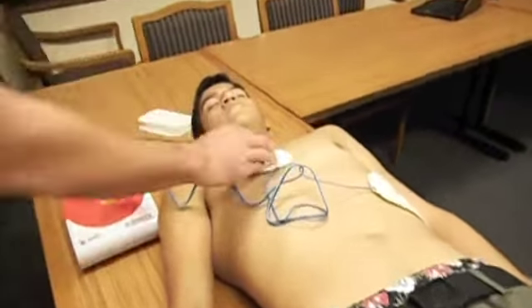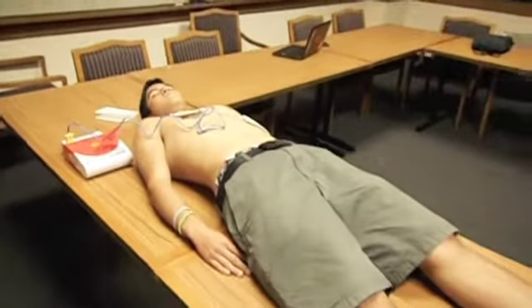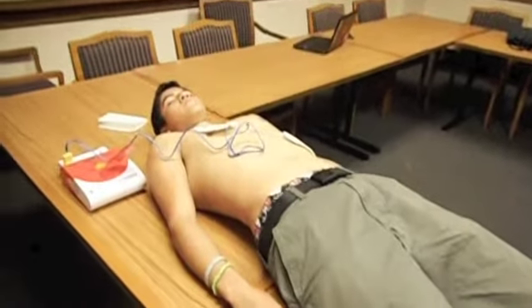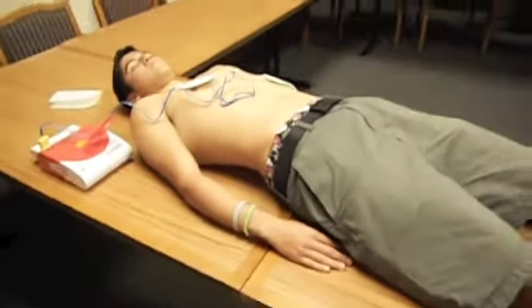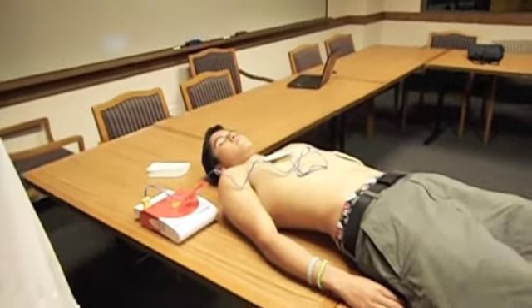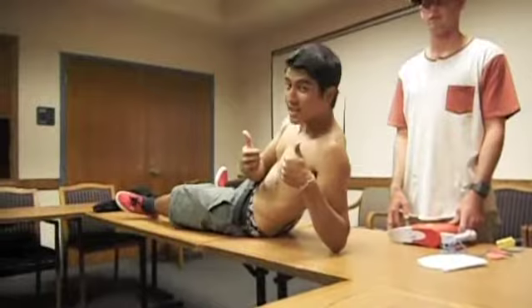Everyone stand clear. Shock advised. Charging. Everyone stand clear. Everyone stand clear. Push the shock button. Shock delivered. Your caveman can do it.